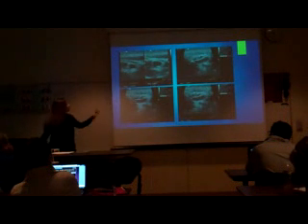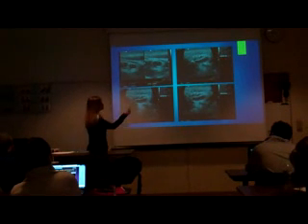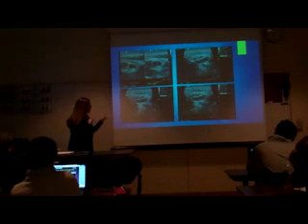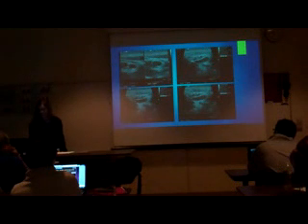And here in our top image on the left, you can see that it was non-compressible. And then on the right, there's an appendicolith stone there with shadowing down posteriorly. And these are just two more images as we scan through in the sagittal view.